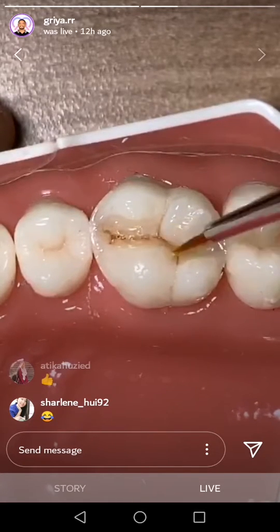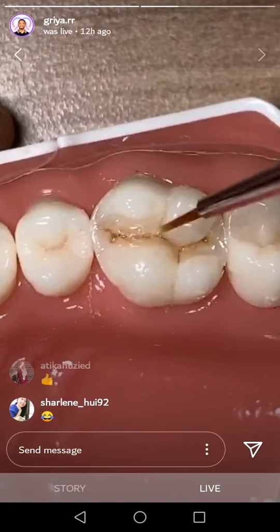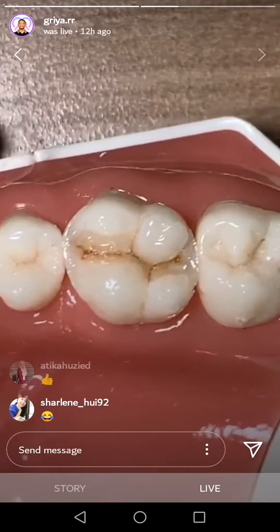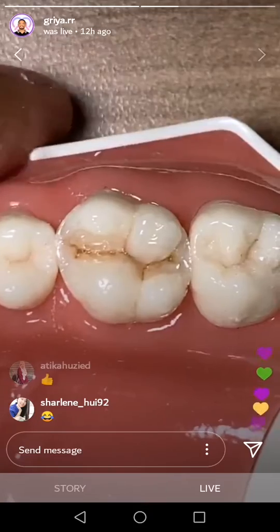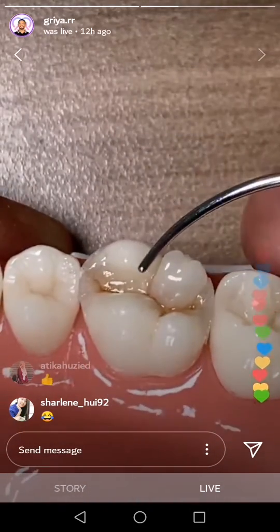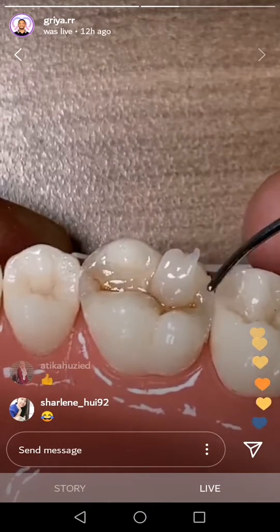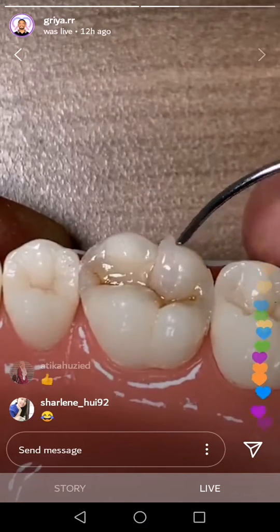Okay, you need to smooth first. Okay, and then remove the excess. Okay, how to remove the excess? It's easy, like this, yeah. Like this. So this is the excess. See?